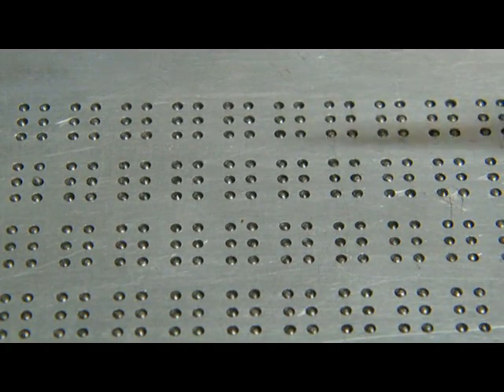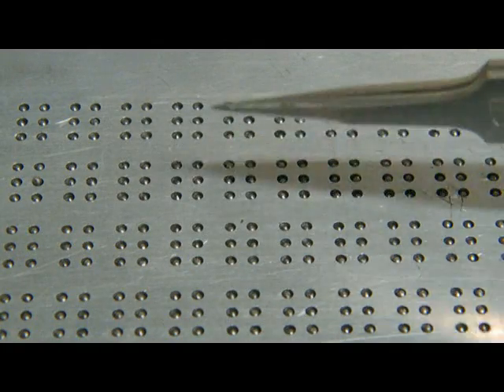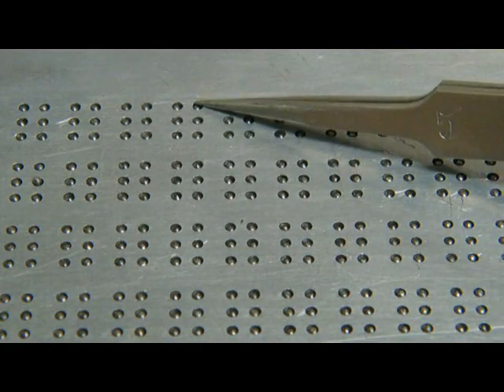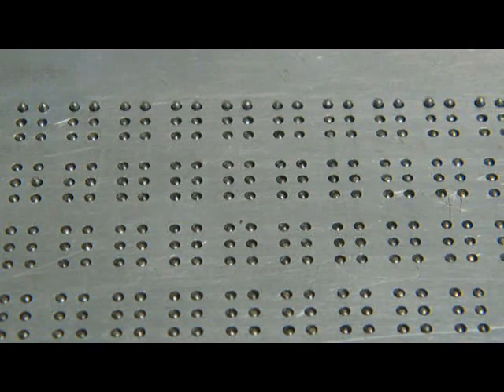I'm going to actuate this line by line over here. That is three rows to a cell. This is the topmost cell, top line. I'm going to actuate that line. Watch the pins jump up. All the pins up, all the pins down, all the pins up.